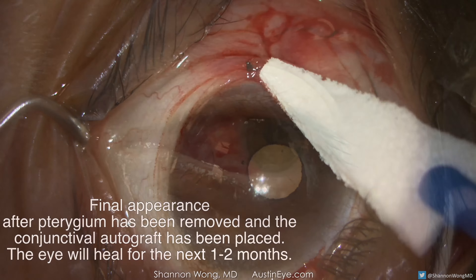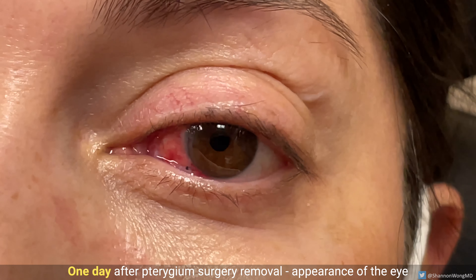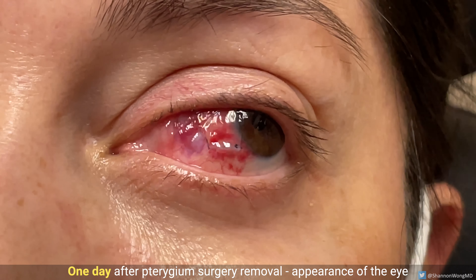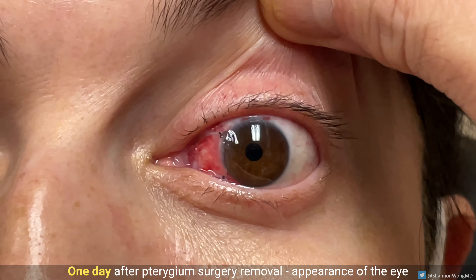This is the appearance of the eye one day after pterygium removal. The suture and autograft are in good position. Subconjunctival hemorrhages in the surgical area make the eye red for the first month after surgery.